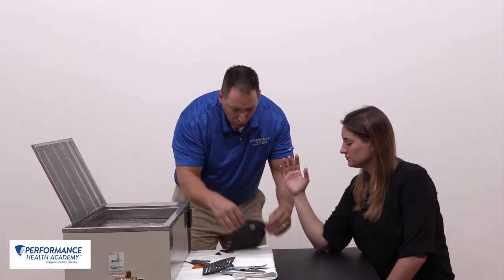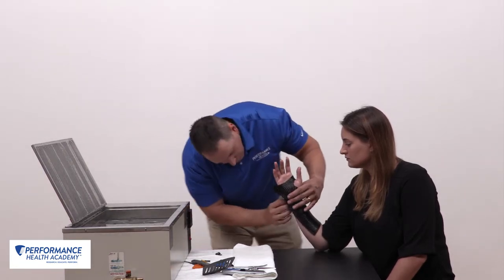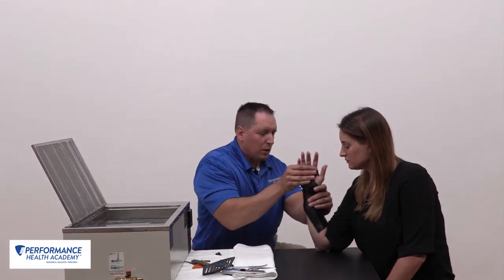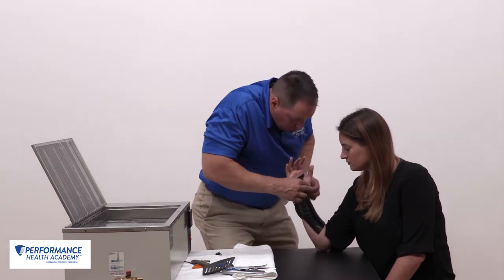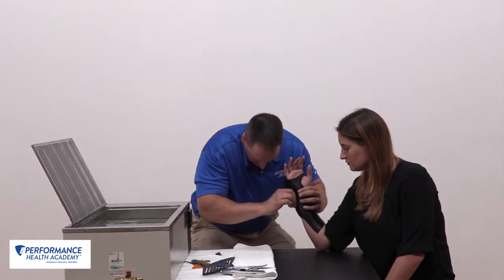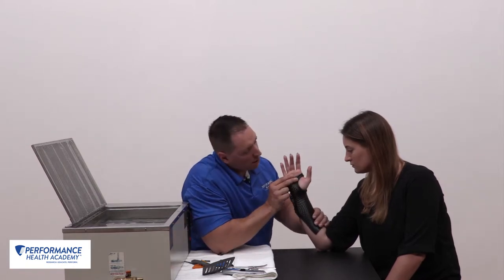Now we're ready to go. I apply this over the thumb, allow it to conform, bring it to the outer border and tack it together — doing the same all the way down. I conform here, and at this point I can choose to roll that material back to clear the thenar eminence and the base of the thumb. Pressing on this material will tack it to the orthotic material. I clear my distal palmar crease and wait for it to cool.